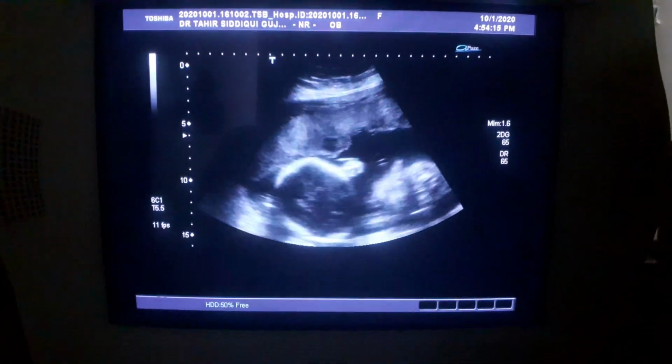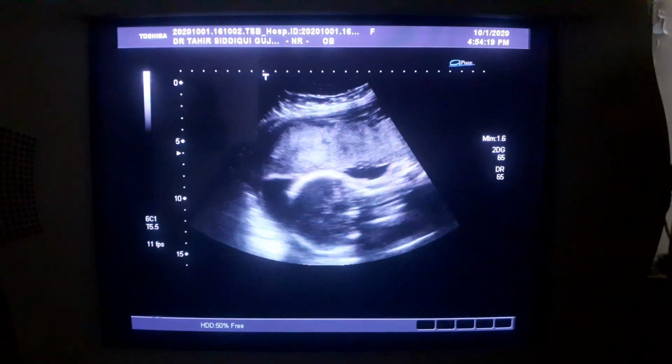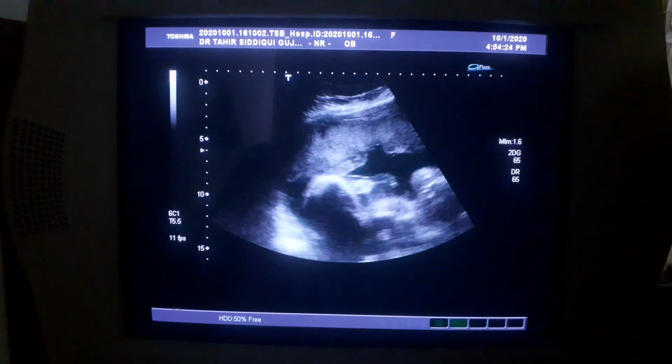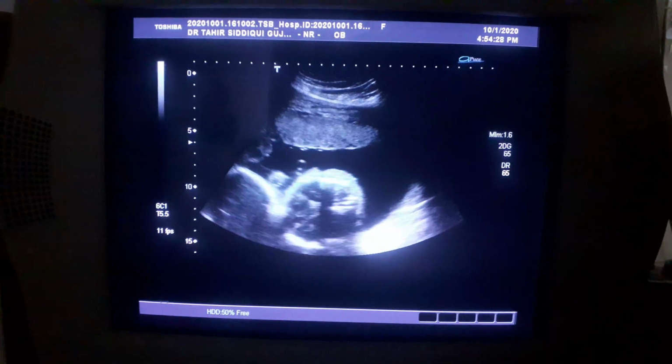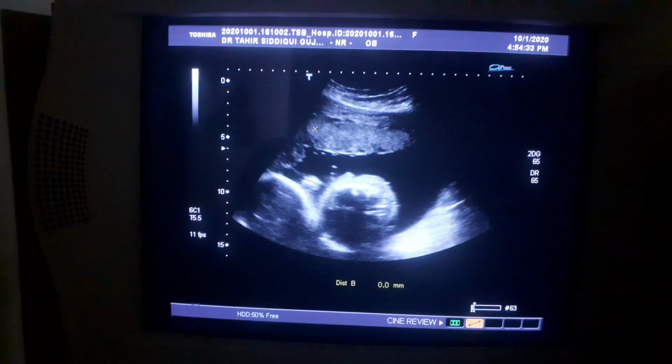Now you see the placenta of fetus number 1 is fundal. Here, this is the placenta of fetus number 1, and this is the placenta which is anterior, that of fetus number 2, this one. This is the fetus number 2.